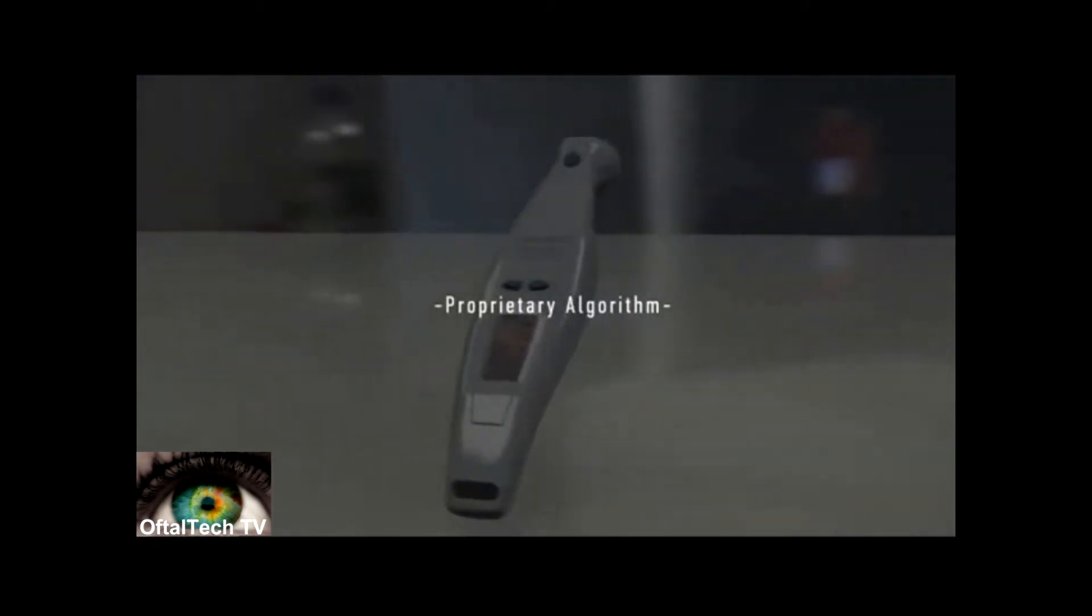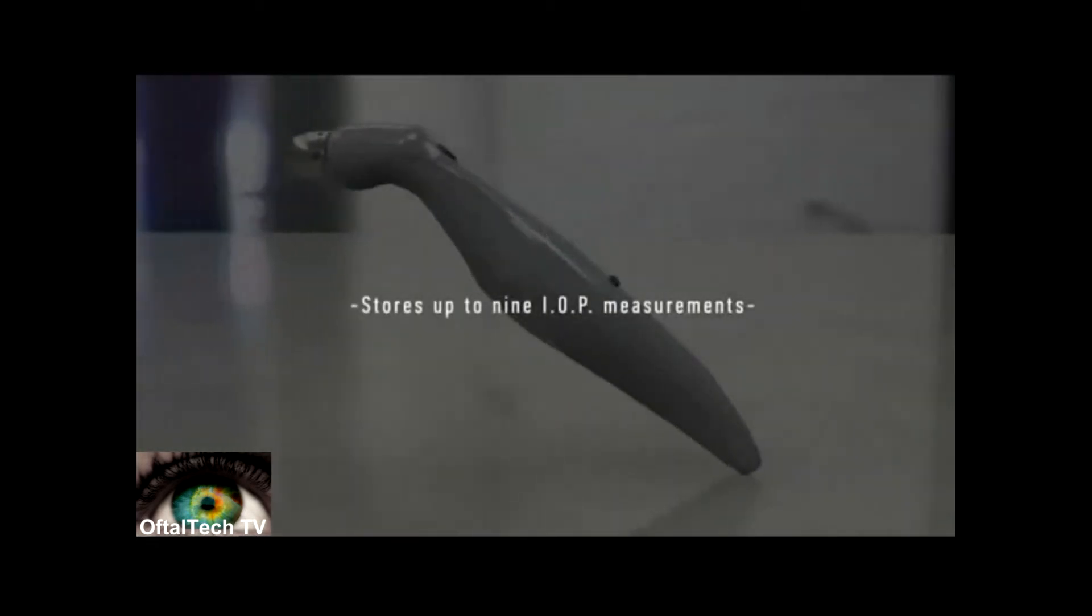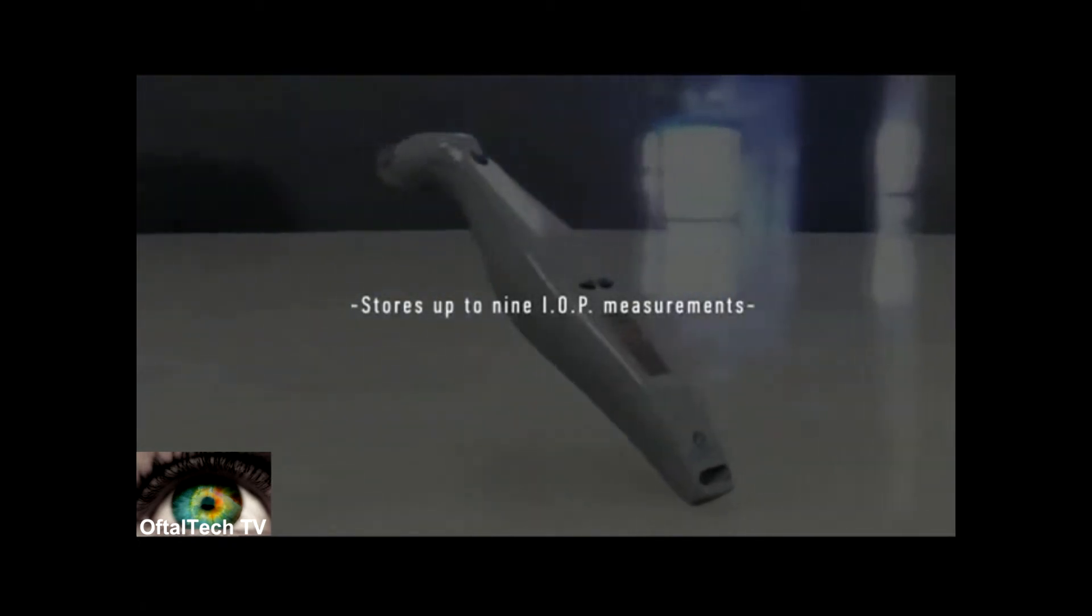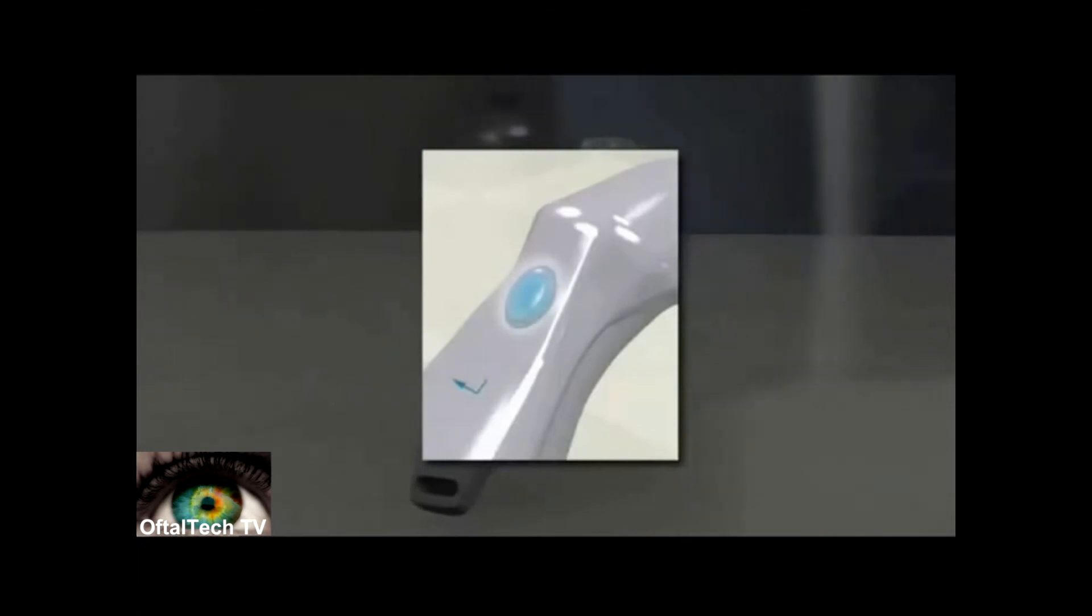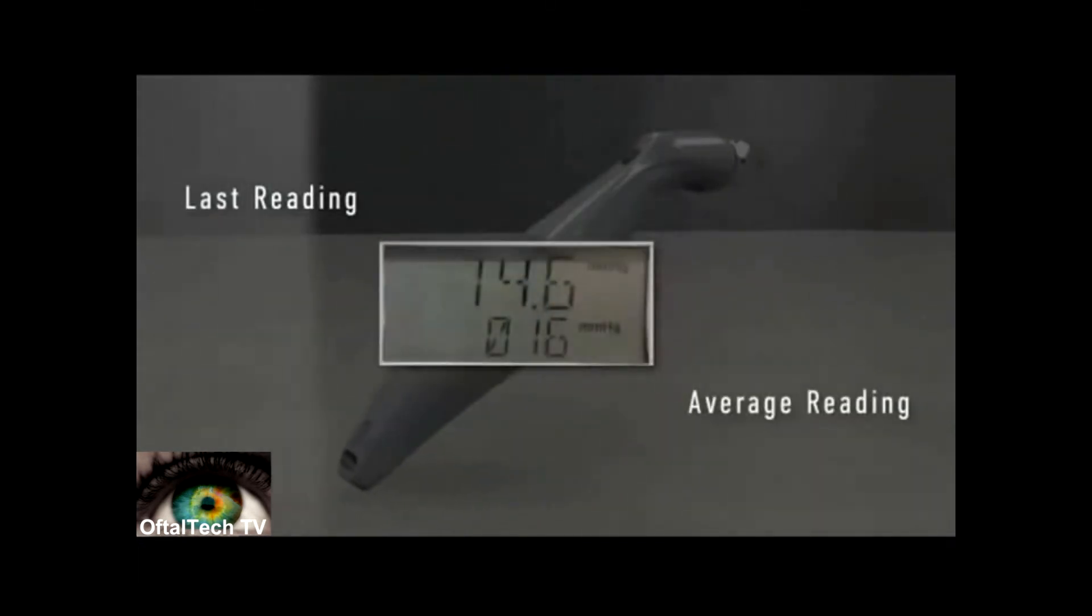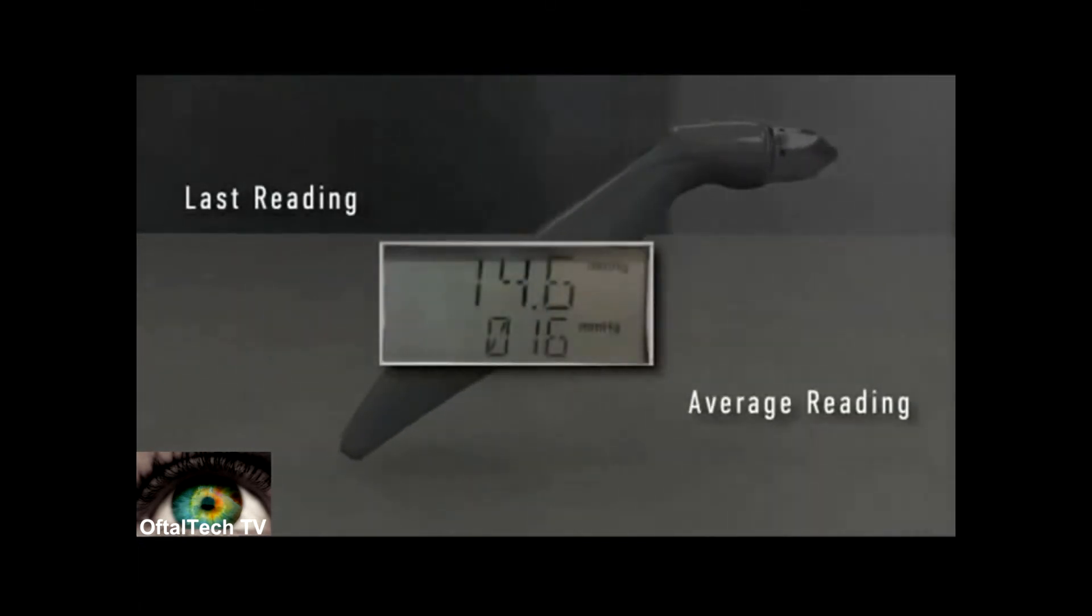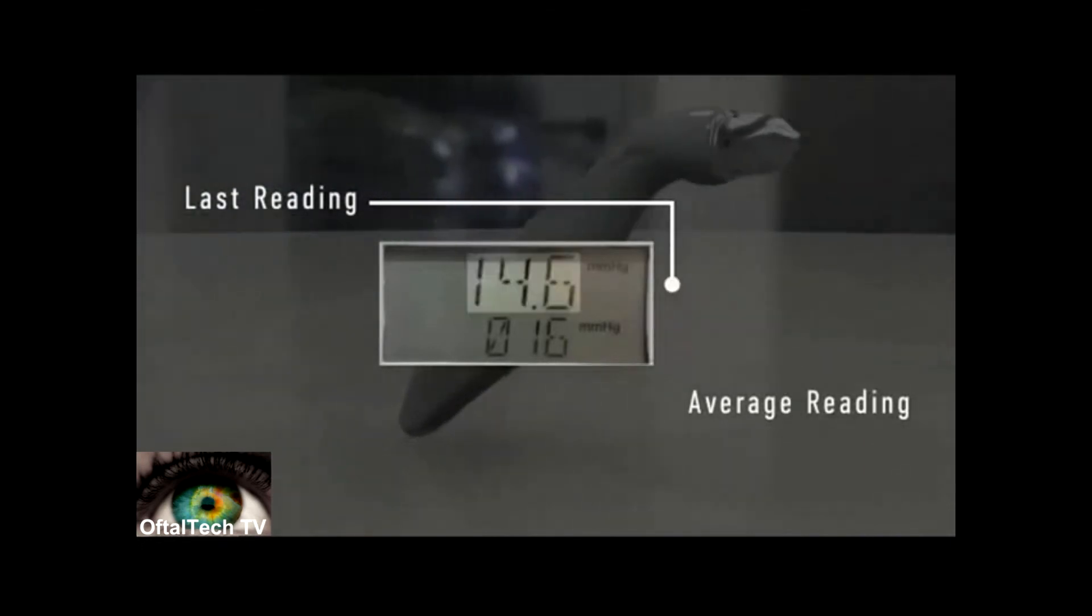The AccuPen has the ability to store nine IOP measurements. Once you have completed a measurement, you can simply press the action button to take another measurement if necessary. The top number on your liquid crystal display will indicate the actual IOP measurement. The number below indicates the average measurement.